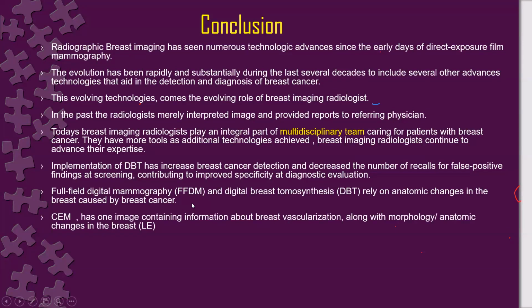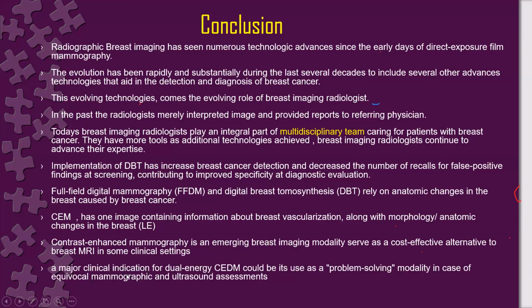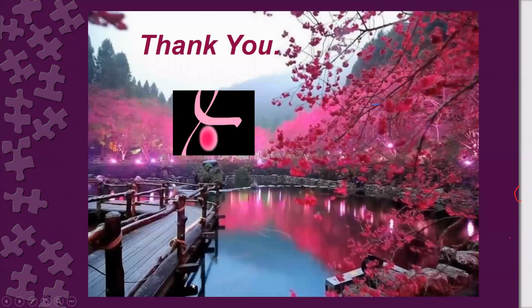However, contrast enhanced mammography demonstrates anatomic or morphologic as well as breast vascularization effects in the recombined image. Contrast enhanced mammography as an imaging breast modality serves as a cost-effective alternative to breast MRI in some clinical settings, and a major clinical indication for dual energy contrast enhanced mammography could be its use as a problem-solving modality in case of equivocal mammographic and ultrasonic findings.